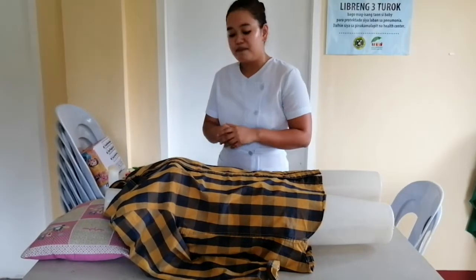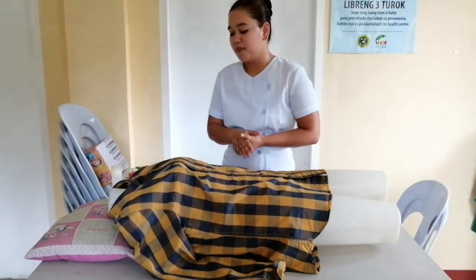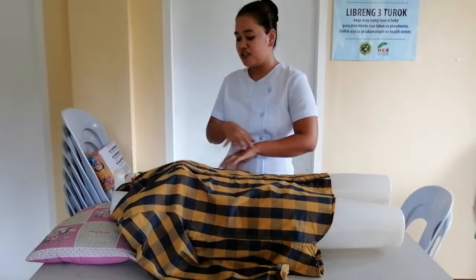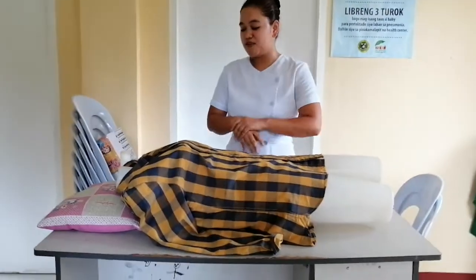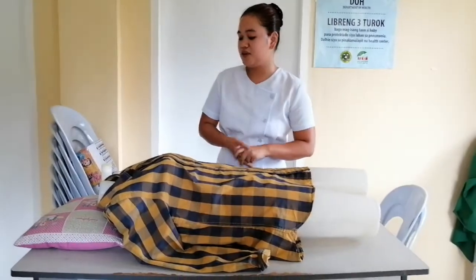Sir, may coins po ba kayo dyan sa bulsa nyo? Or yung mga watch po na nilagay sa any metallic accessories po sa katawan nyo? Okay, if the client's answer is correct, that he has nothing on his body, then you may proceed with the following procedures.